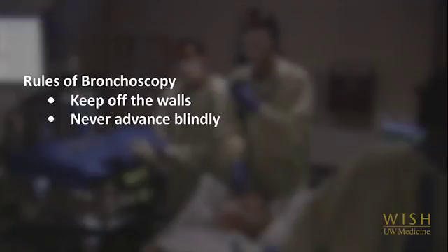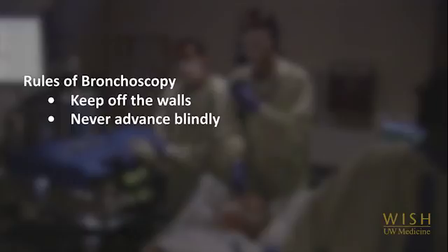If you cannot see where you are going, advancing could lead to trauma. Try to clear the tip of the bronchoscope with gentle suction or by instilling 3-5ml of saline through the suction channel. You can also try to wipe the tip of the bronchoscope on the wall of the trachea.